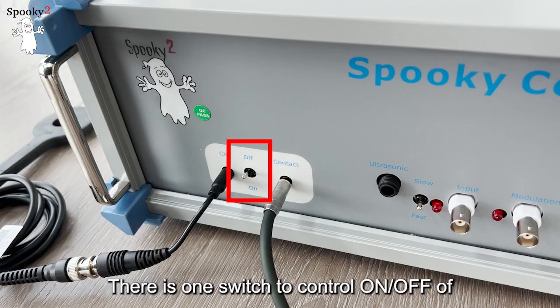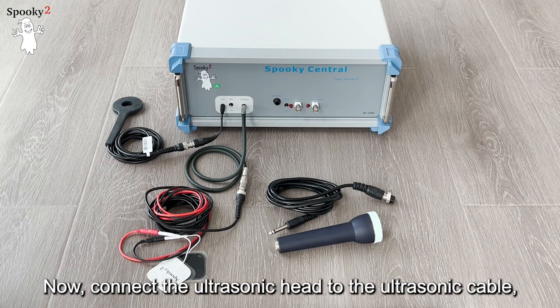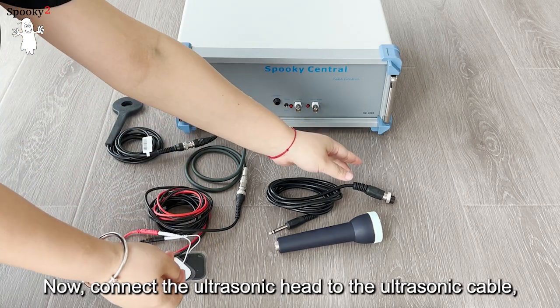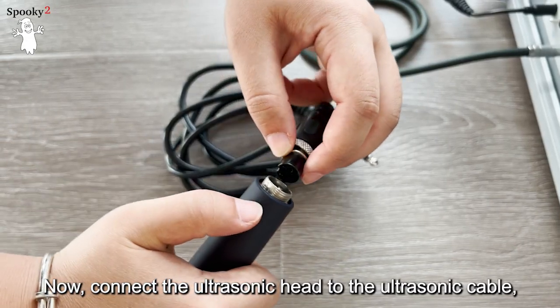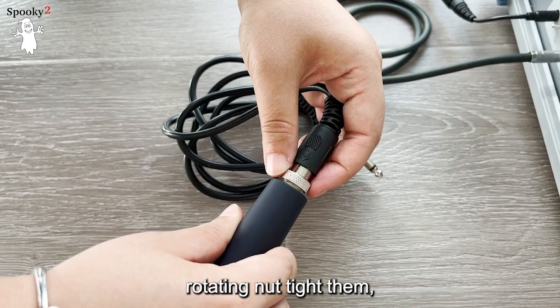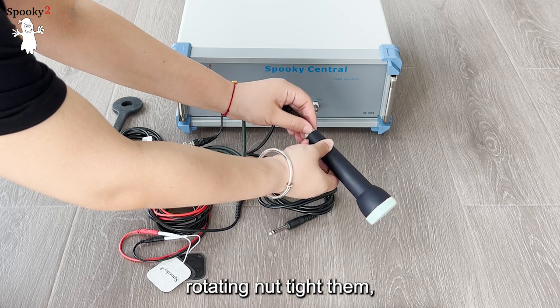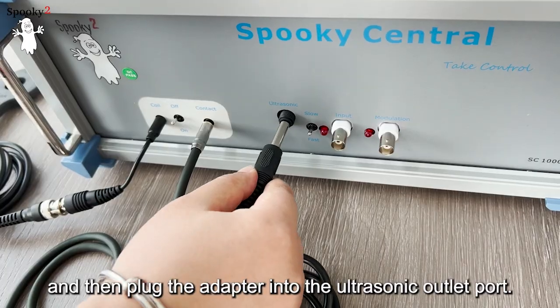There is one switch to control on and off of both PMF and contact channels. Now connect the ultrasonic head to the ultrasonic cable, rotating the nut to tighten them, and then plug the adapter into the ultrasonic outlet port.